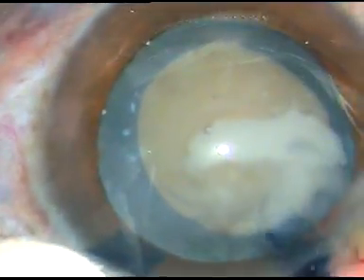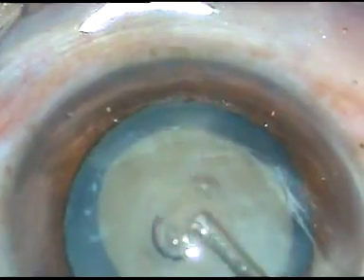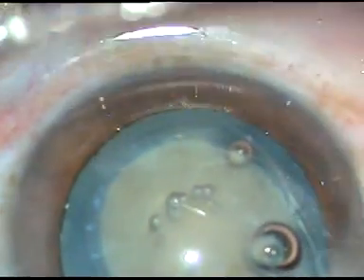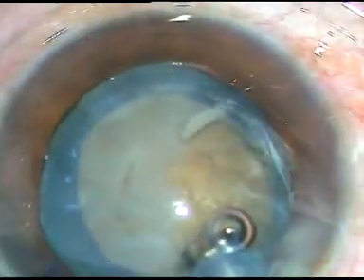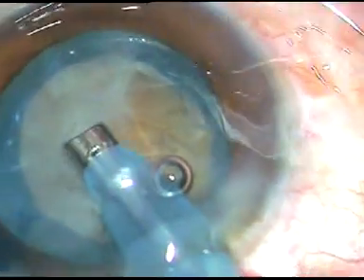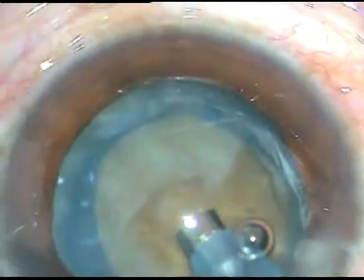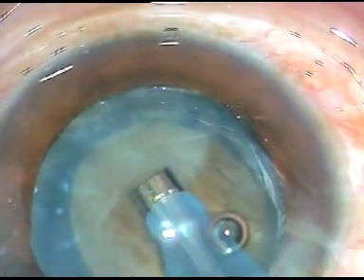I have been able to do an adequate-sized capsulorrhexis on-the-go in this case. Now is the time to introduce the tip of the phaco handpiece. I remove the air bubbles for better visibility and remove some superficial cortical lens matter, which in this case has degenerated into milky material.